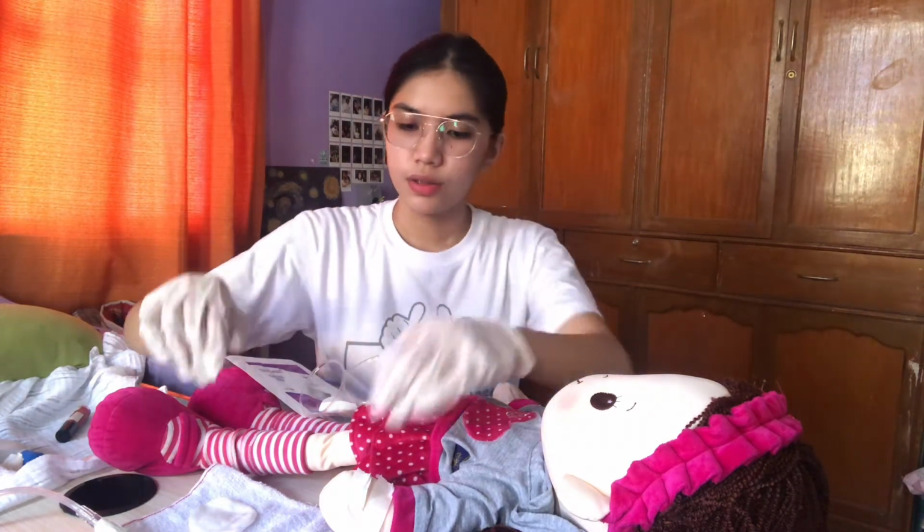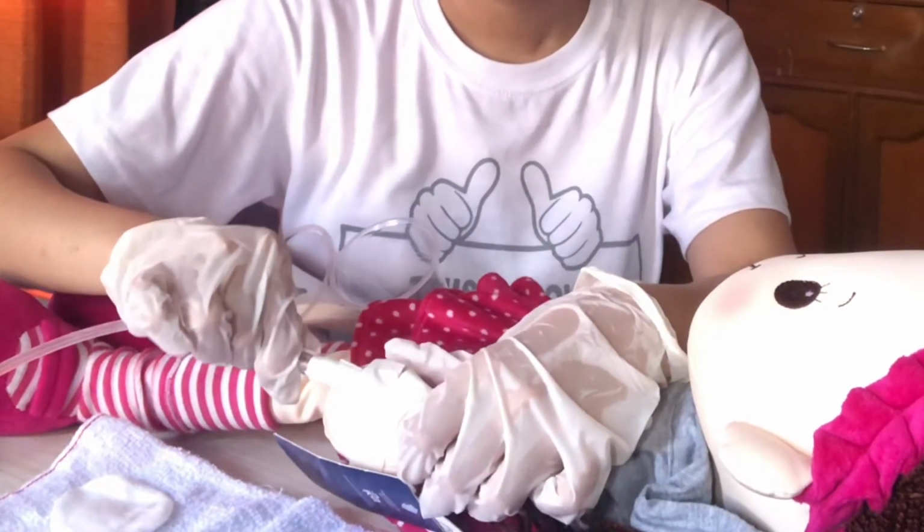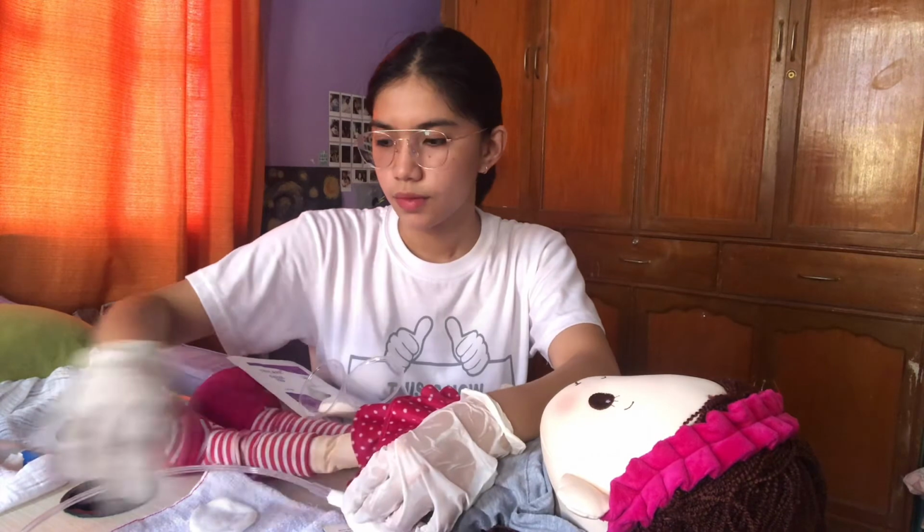Connect the new tubing and reestablish the infusion. So, ma'am, I'll be connecting the new tubing. So, continue to hold the catheter and grasp the new tubing with your dominant hand. Remove the protective cap and maintain the sterility. So, insert the tubing end securely onto the needle hub. Twist it to secure. And then we will open the clamp to start the solution flowing.